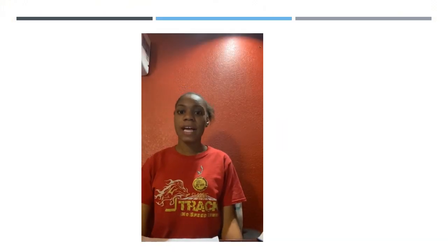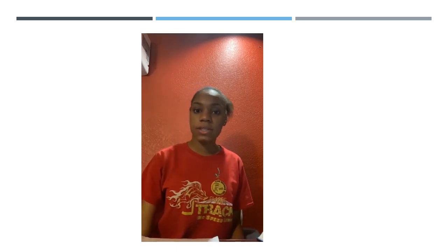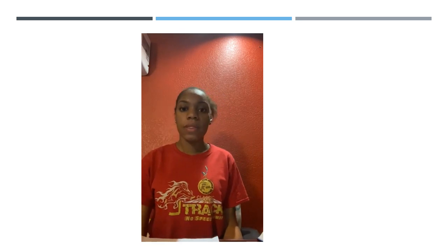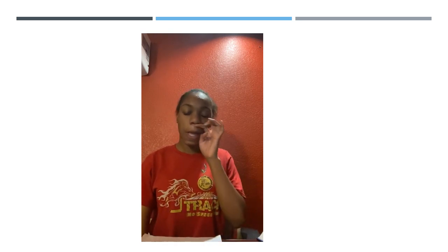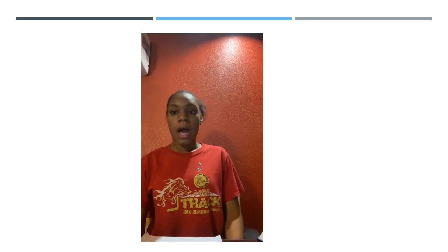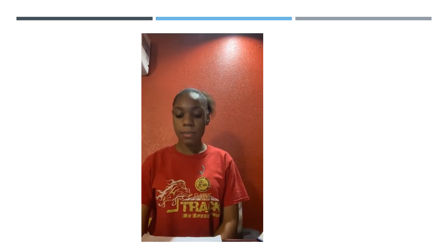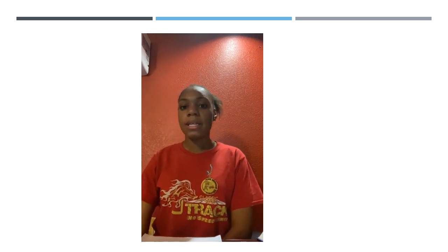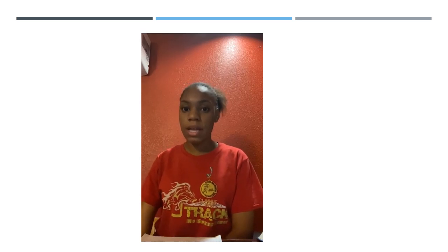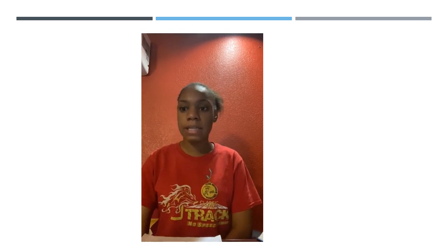My name is Trisha Lee, and today I'll be talking about hemodialysis. I'm pretty sure all of us had a rotation on the dialysis unit, so we know what the procedure for hemodialysis is. Hemodialysis can be considered as the separation of the blood. It is a procedure where a patient's blood is circulated through a dialyzer to remove waste product and excess fluid. It is basically used for patients who are acutely ill and require short-term dialysis, sometimes days to weeks, or it can advance to long-term because they may be getting hemodialysis for years.